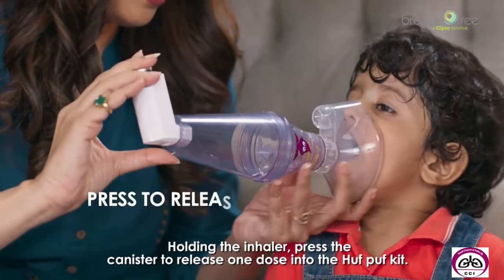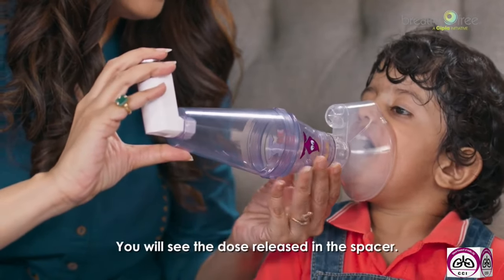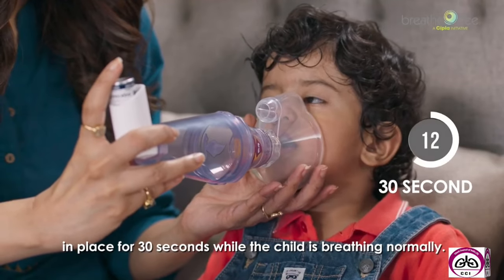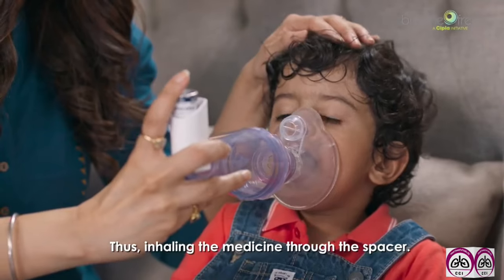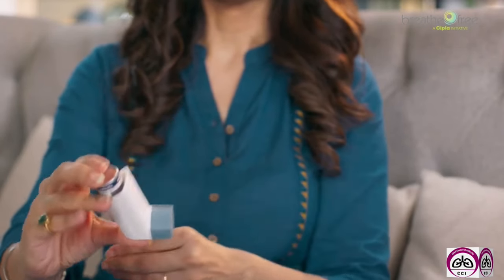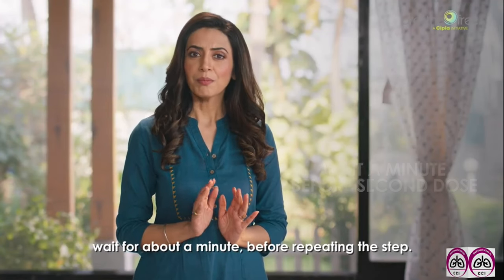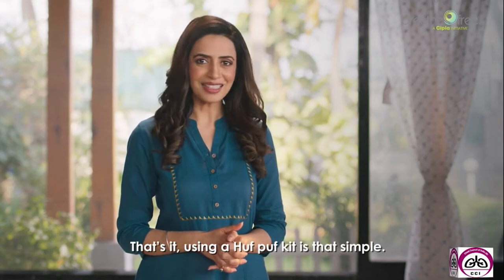Holding the inhaler, press the canister to release one dose into the Huff Puff kit. You will see the dose released in the spacer. Hold the Huff Puff kit in place for 30 seconds while the child is breathing normally, thus inhaling the medicine through the spacer. Remove the inhaler from the Huff Puff kit and close the mouthpiece cap of the inhaler. If a second dose is prescribed, wait for about a minute before repeating the steps. That's it. Using a Huff Puff kit is that simple.